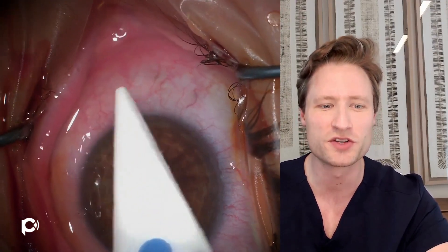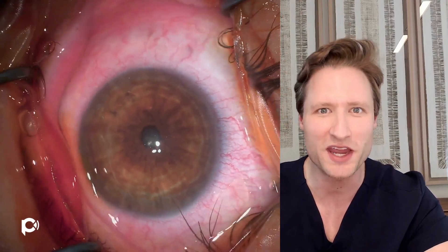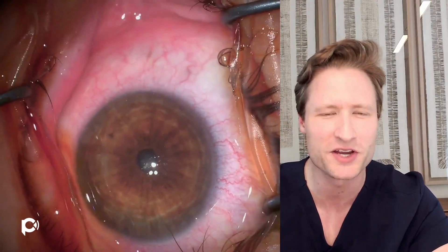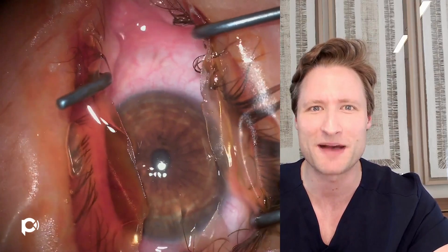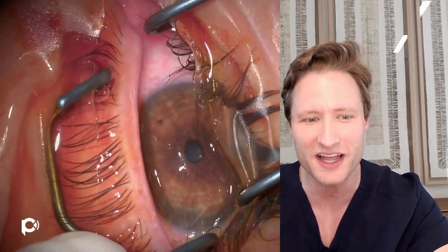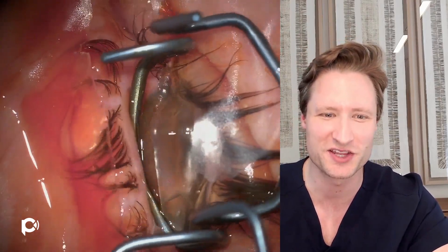What we're doing here is just positioning the patient and the speculum for maximal comfort and visibility. The whole operation really just takes about five or six minutes, so you've got ample opportunity to make sure that everything is aligned and the speculum is just how you like it, so things can be done properly. Here we are just repositioning the speculum.